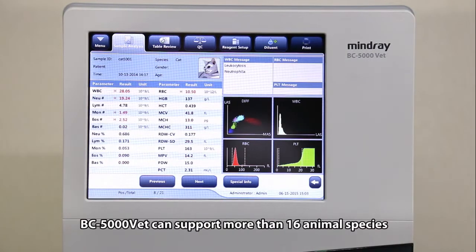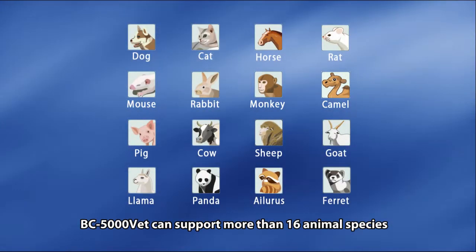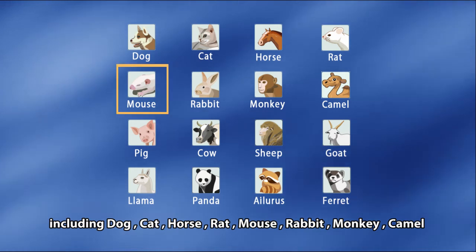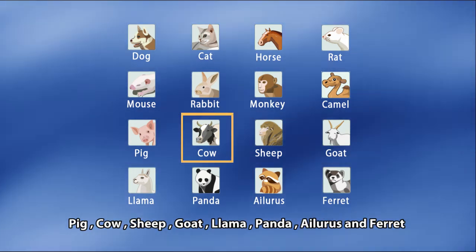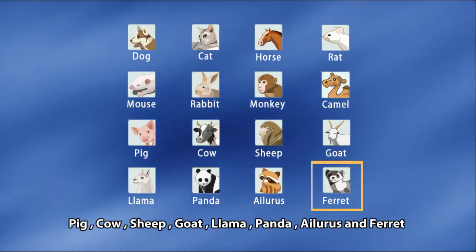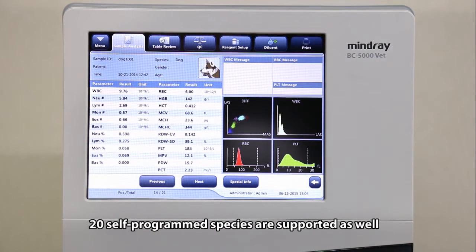BC 5000 VET can support more than 16 animal species including dog, cat, horse, rat, mouse, rabbit, monkey, camel, pig, cow, sheep, goat, llama, panda, ilurus, and ferret. Meanwhile, 20 self-programmed species are supported as well.